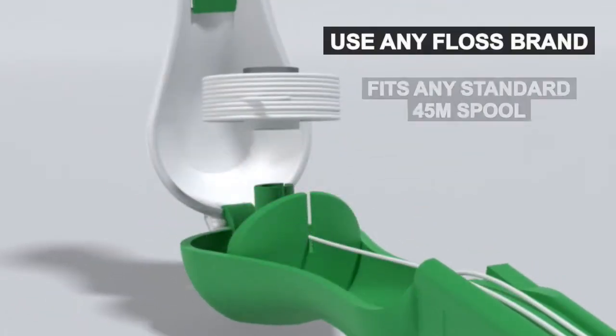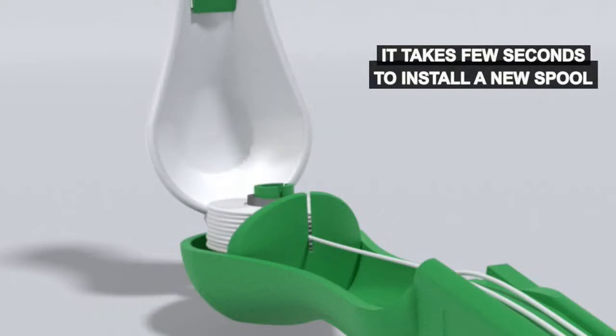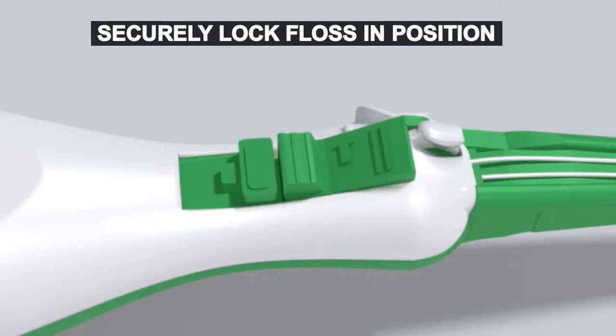Use any floss brand that fits the standard 45-meter spool. It only takes a few seconds to install a new spool. The patent-pending locking mechanism securely locks floss in position.